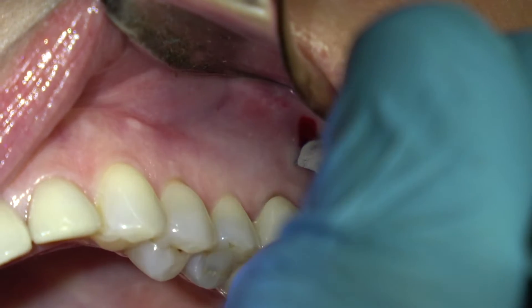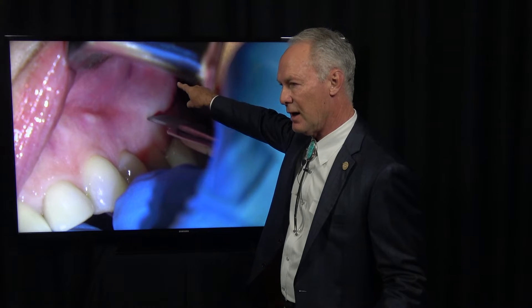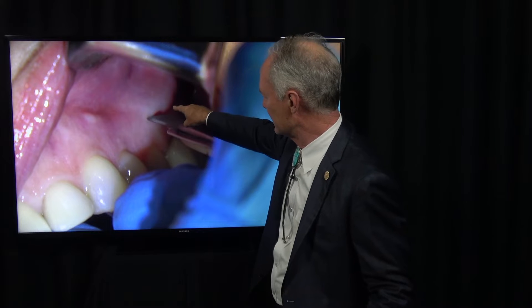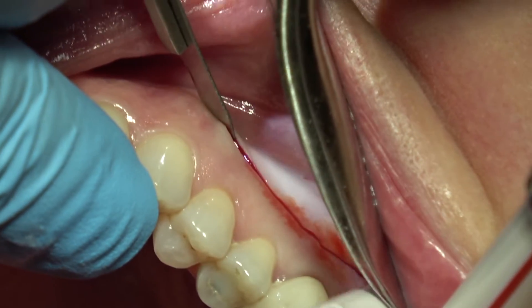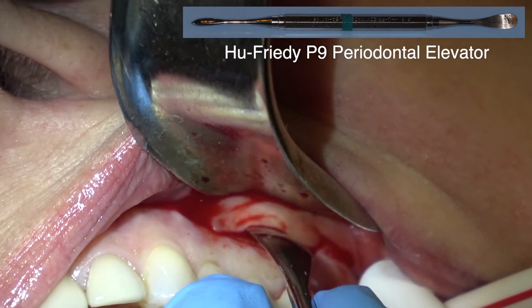This is a semilunar incision from the unattached non-keratinized gingiva into the keratinized gingiva. If possible, you want to make the incision in keratinized gingiva because the sutured flap is more stable. It's a semilunar full-thickness flap all the way to bone.